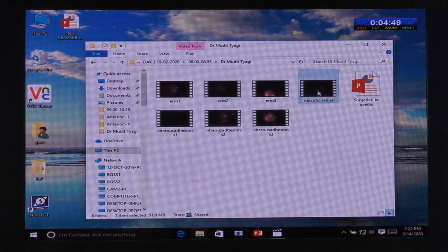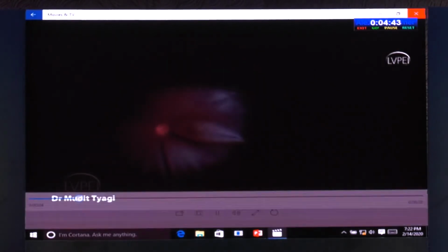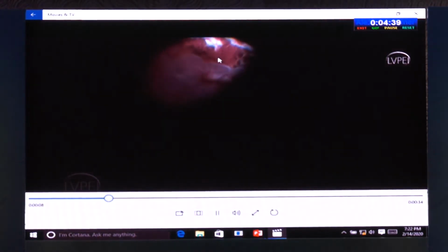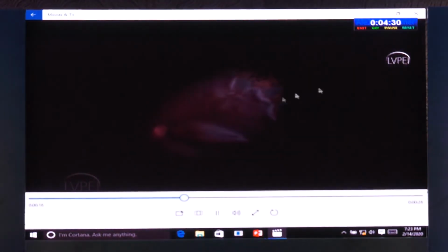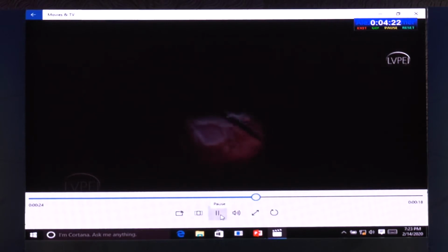Apart from that, one more problem you face is the peripheral necrotic retina. The retina in these cases is totally necrotic. You will see multiple patches of necrosis and peripheral breaks, and these are the areas from which the detachment occurs. So you have to be careful even while doing a vitrectomy. If you try to induce a PVD or pull too much, you will end up creating more breaks than you would otherwise hope for. You can truncate or shave your vitreous over here instead of doing anything else.